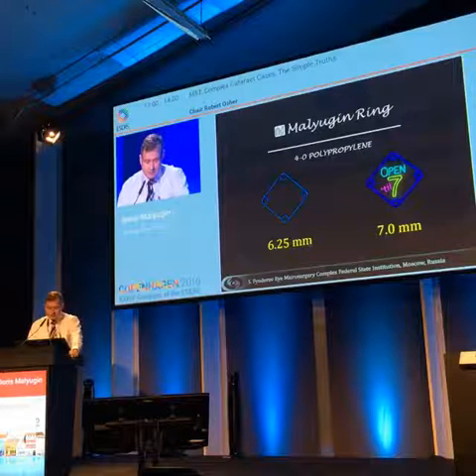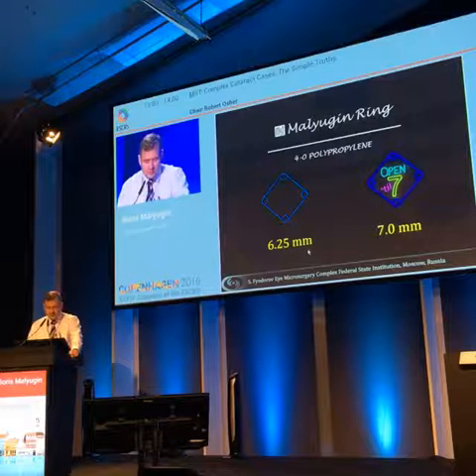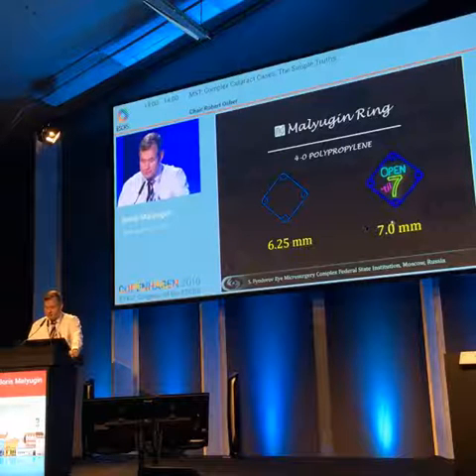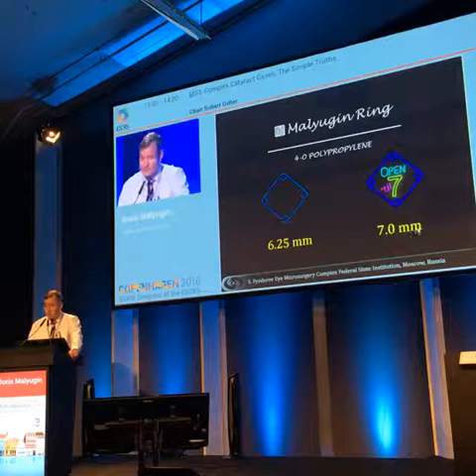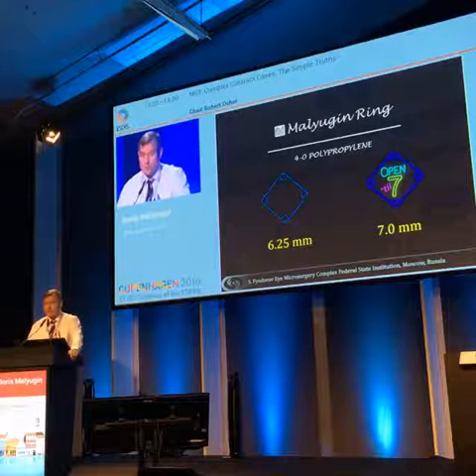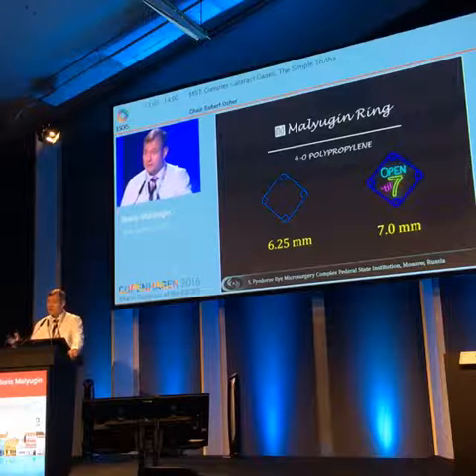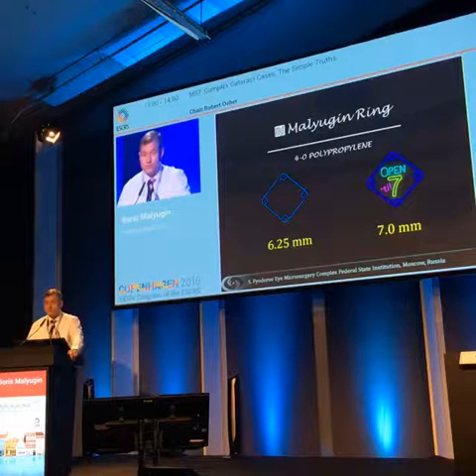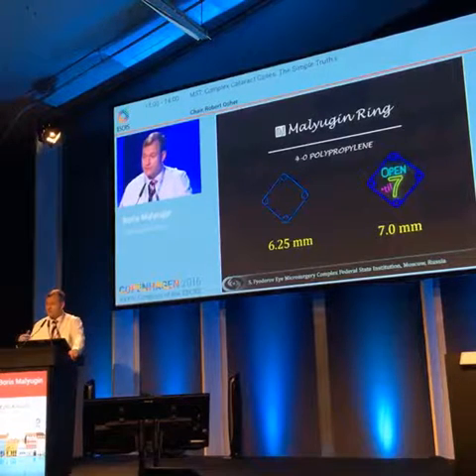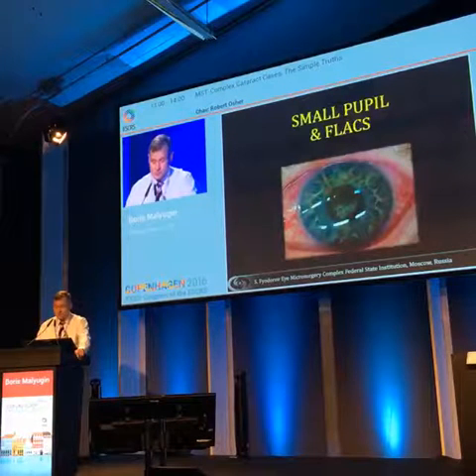Just briefly to remind you that the original versions came in two sizes, 6.25 and 7. I personally like 7 for IFIS cases that were nicely shown in previous videos, and 6.25 for regular cases, myopic cases, fibrotic, uveitic, when you don't want to expand the pupil too much and overly traumatize the iris, and to avoid notches postoperatively.